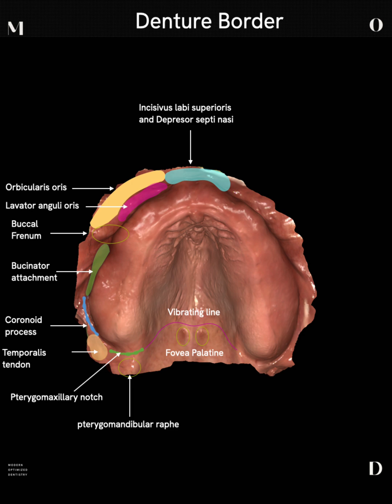First and foremost, you need to at least get back to the vibrating line. The vibrating line is where the soft palate meets the aponeurosis of the tensor veli palatini. It's fairly easy to distinguish on an intraoral scan. There are classes of soft palates — class one, two, and three — depending on the severity of the angulation of the palatal vault.